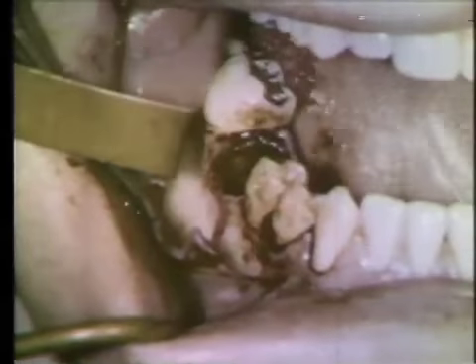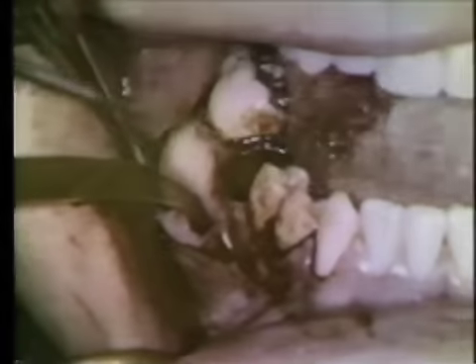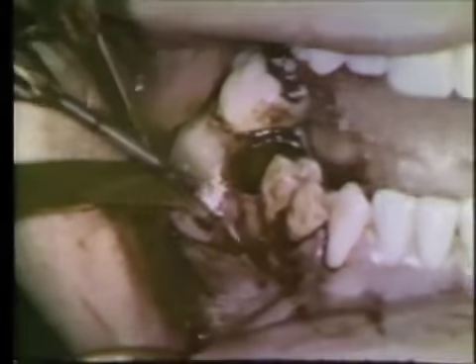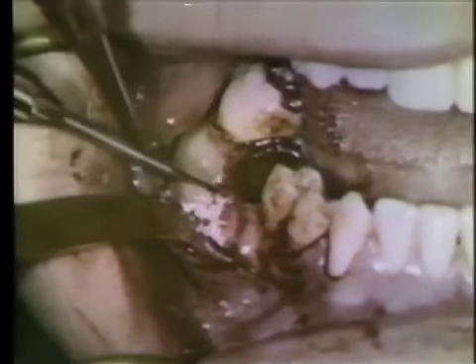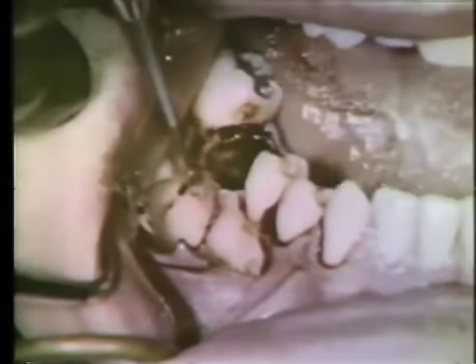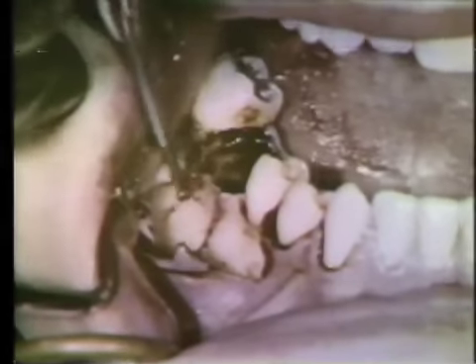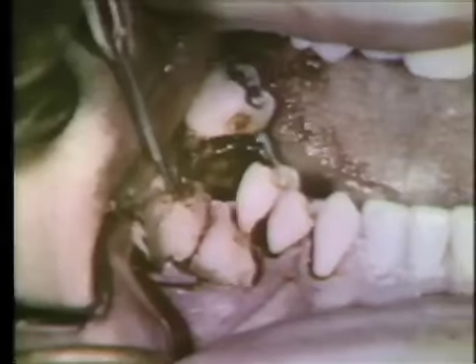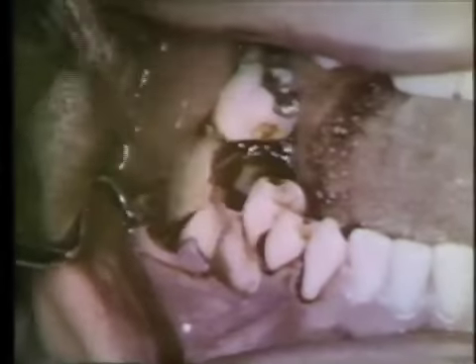This template was made from those casts that were just shown. It is a metal guide that takes into account the dimension of the drill cut. And with such a template, it is possible to be quite accurate within fractions of a millimeter in the quantity of bone that is removed.